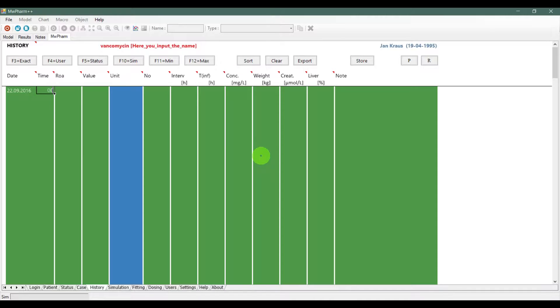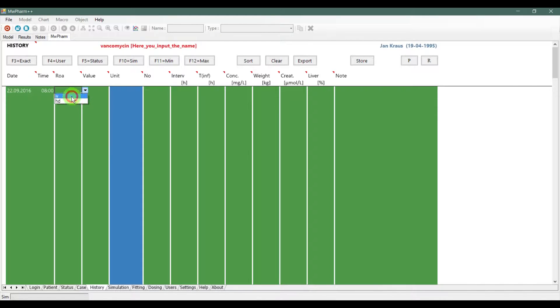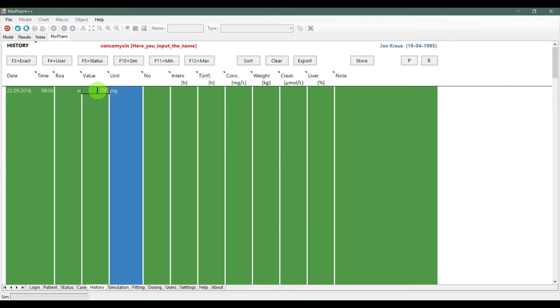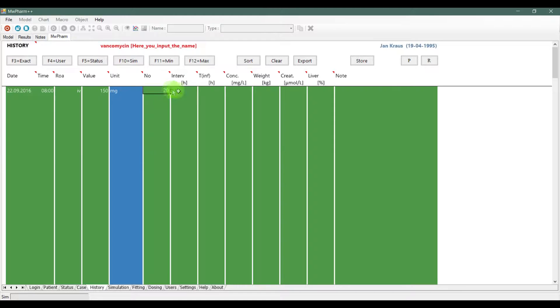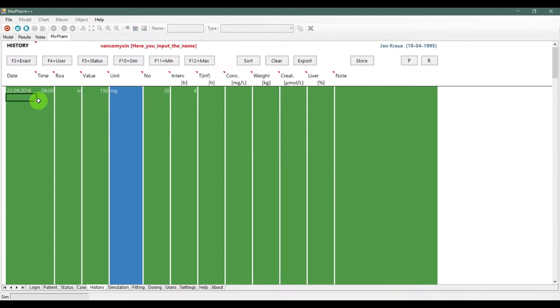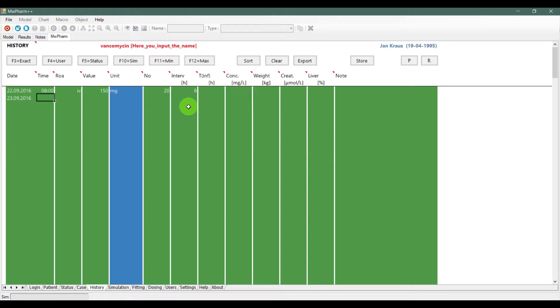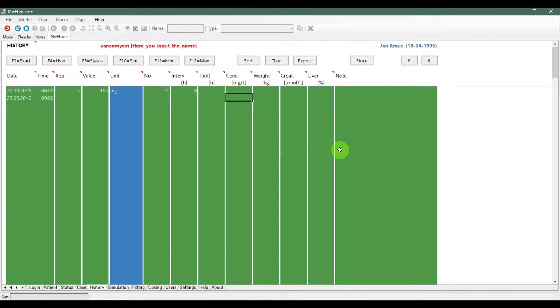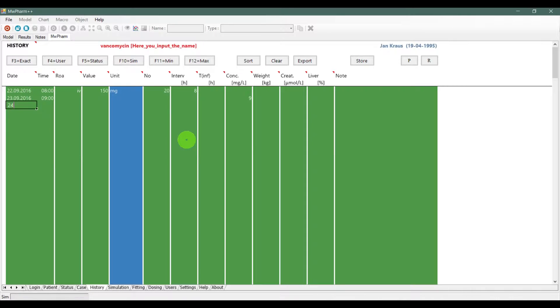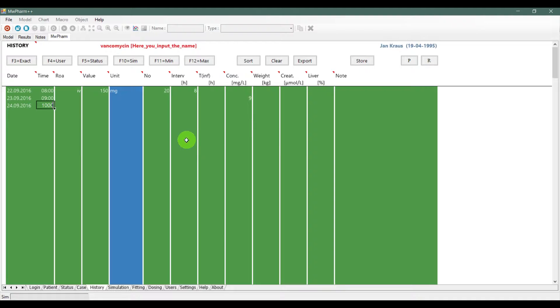Now, you have been transferred to the history tab. Here, you can input the doses and measurements you made. To test this, we will dose our patient with 150 mg of vancomycin four times a day. We will also create two measurements of the drug, so we can fit the data later.